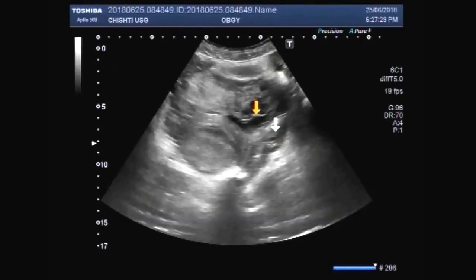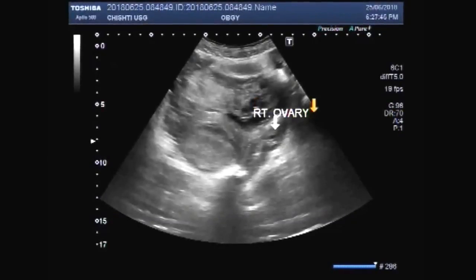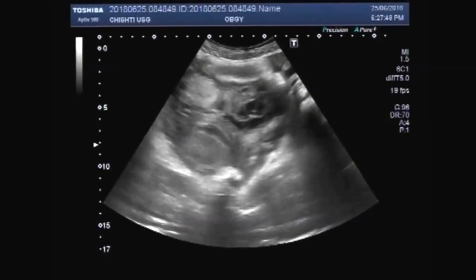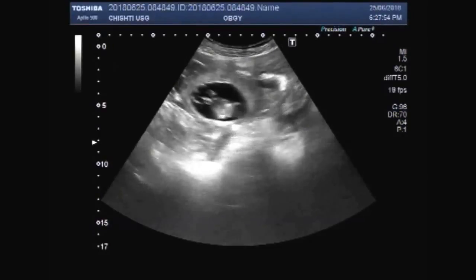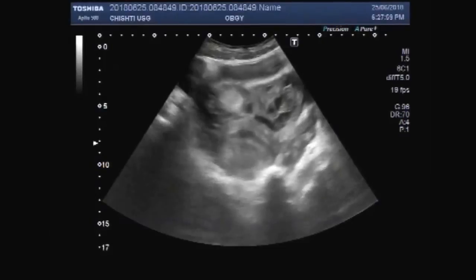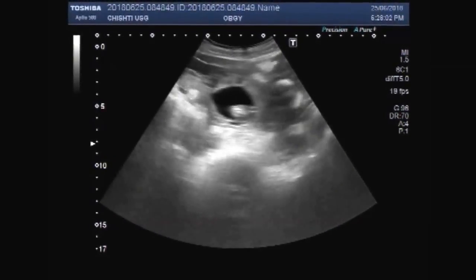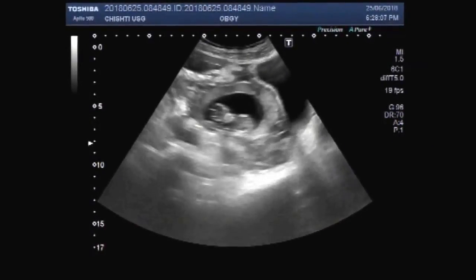This is the right ovary. You can see the left ovary having an active, alive fetus.